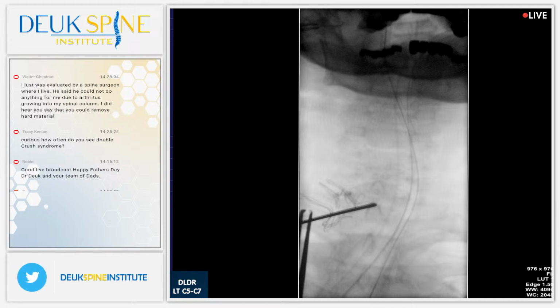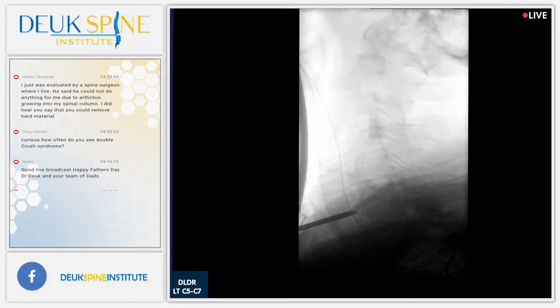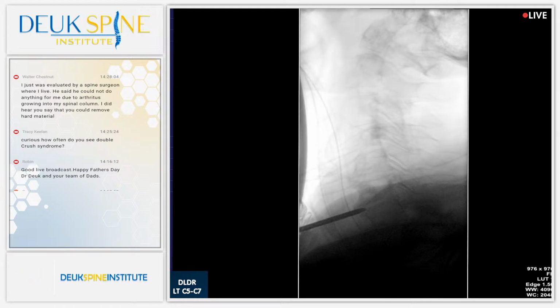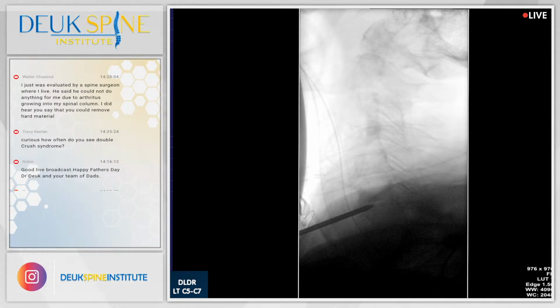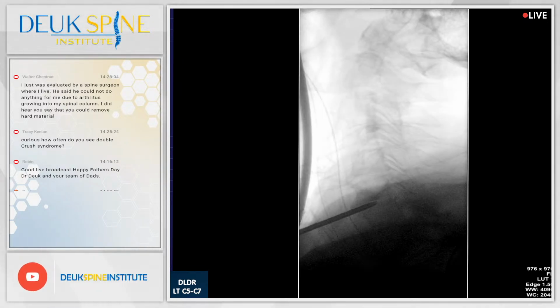This is the mountain. Shot. You guys see that little peak there, and we got a little bird's mouth. Shot. Yes, we do. All right, going in. Shot. You know, they say it's better to be lucky than good, and I agree. I'm going to try another discogram. It's a pretty collapsed disc. Everyone agree we're at 6-7? That's our second disc, correct?